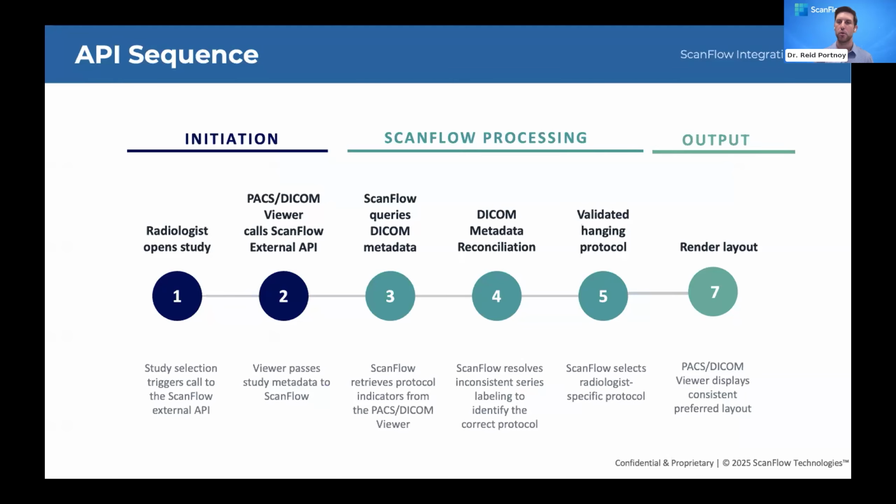And again, just so we're all on the same page, we want the radiologist to do what's best for them. Radiologists all train differently and practice differently. So we want the radiologist to have the hanging protocol that works for them, and we make sure it's consistent every single time.